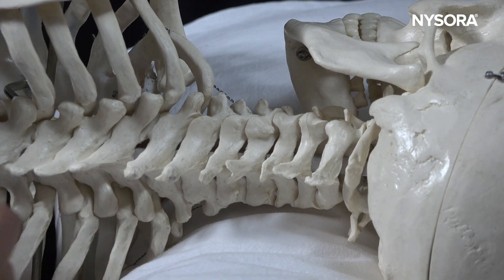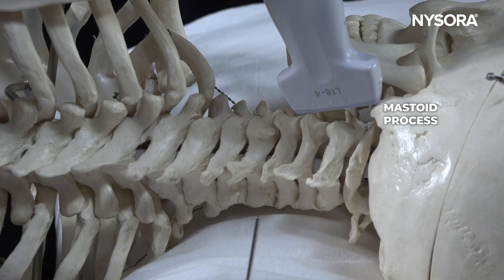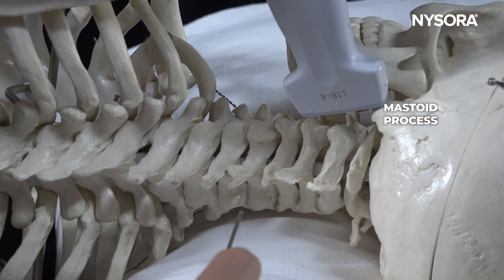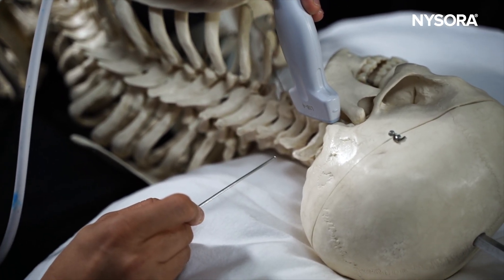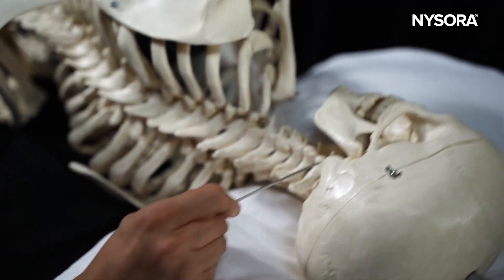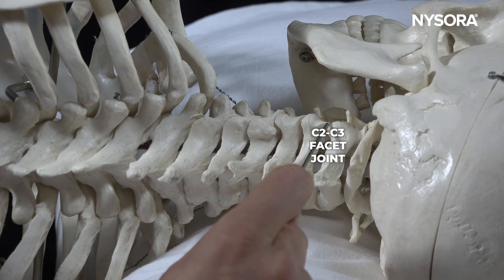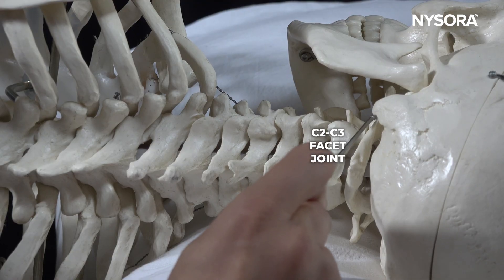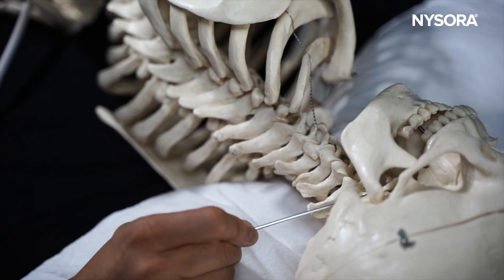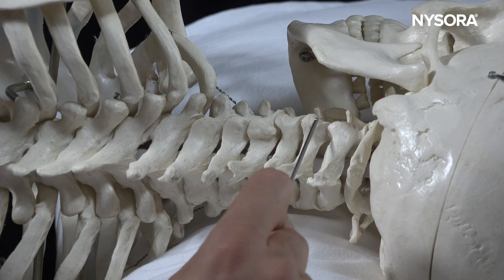The starting point when using ultrasound guidance for the cervical medial branches is the mastoid process. You put the ultrasound on the top of the mastoid process and look for the sternocleidomastoid muscle, which is inserted on the mastoid process. Go about half a centimeter below and anterior, and you will start to see the first joint, which is the C2-C3 joint. This is the first joint visible on ultrasound because C1 is just a ring, making it very difficult to identify the C1-C2 joint in the lateral position.